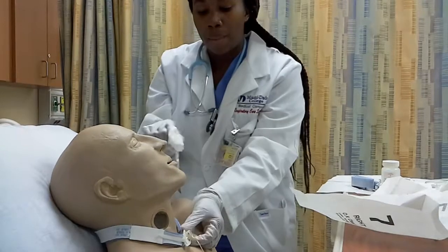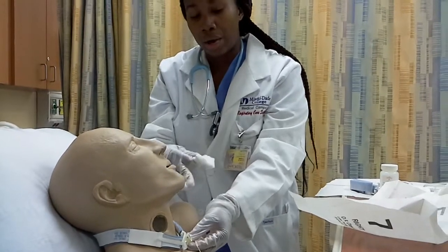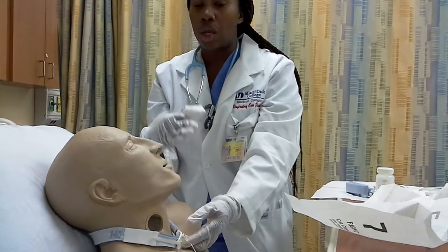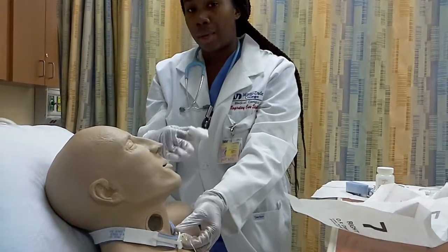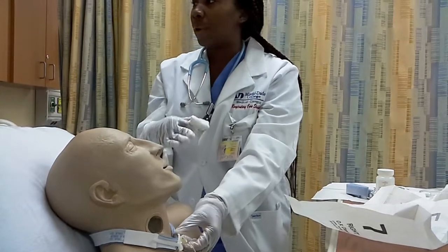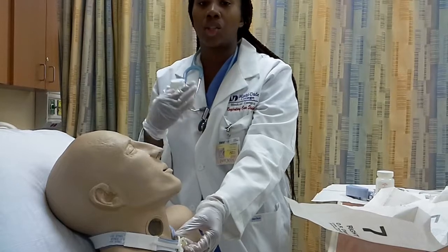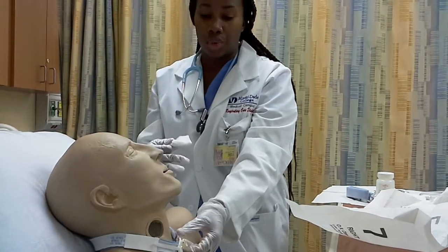While I'm cleaning, I'm going to make sure I'm assessing his stoma area to make sure there is no irritation or redness, because that would indicate that there is some type of skin breakdown going on. Also, I'm going to make sure I'm monitoring all of his vital signs, his pulse ox, his heart rate, to make sure he's not desaturating during the procedure.